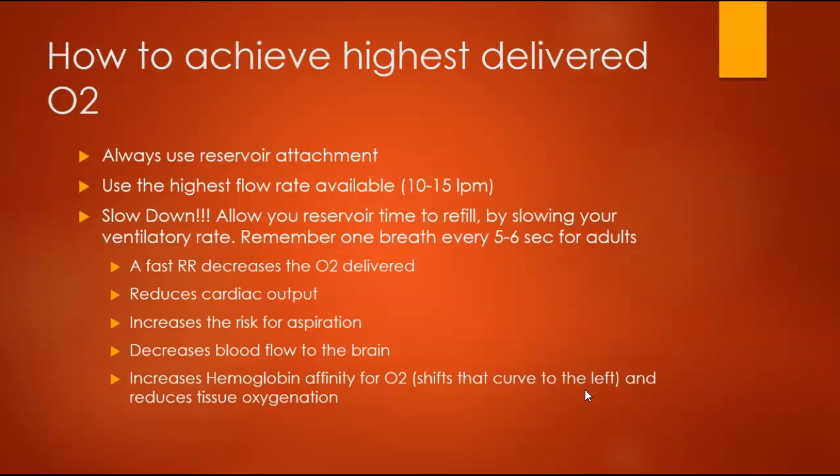So by slowing down your respirations, you're allowing that reservoir time to refill. Because your reservoir has time to refill, that means you're going to give a higher percentage of oxygen to the patient. So fast respiratory rates decrease O2 delivery. It's also going to reduce your cardiac output.